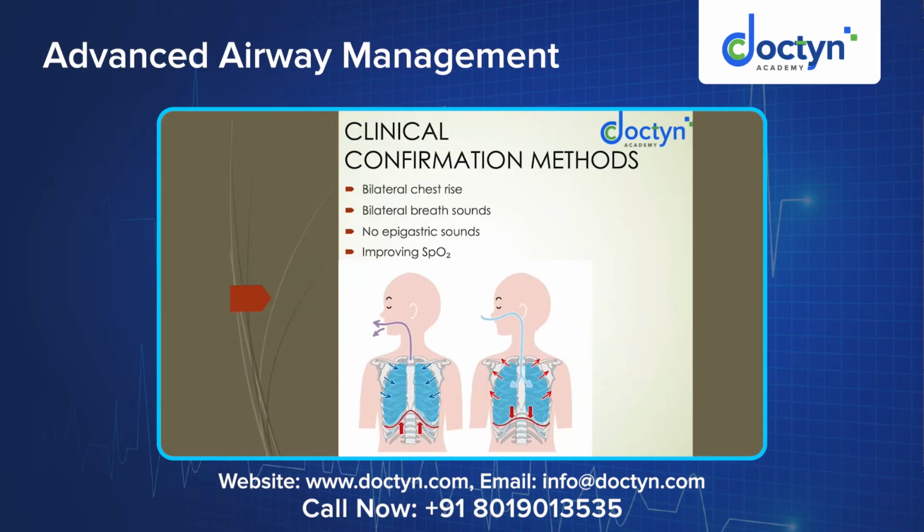What are the other methods to confirm endotracheal intubation? Bilateral chest rise, auscultating bilaterally, and you have to auscultate in the axillary regions. On the anterior region, you might get a transmitted sound, or you would not hear it clearly. If the patient is very tachycardic or cachexic, you will not be able to hear it properly. So that's why the infra-axillary region is the right location to auscultate. No epigastric sounds: in the epigastric region, you auscultate, but there is no gurgling or sounds over there. That also confirms it. And the saturation, which is already there, improving or being maintained, is also a sign of confirmation.